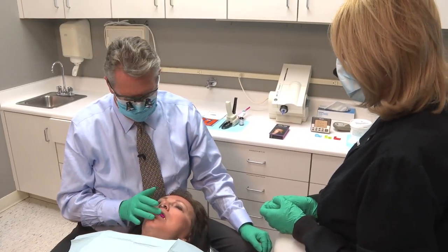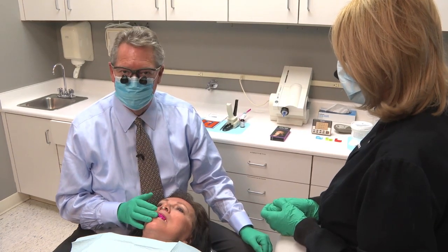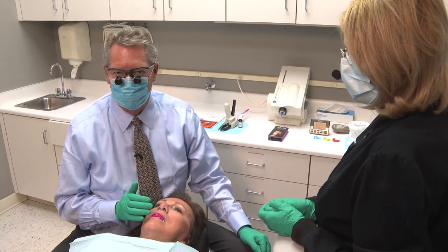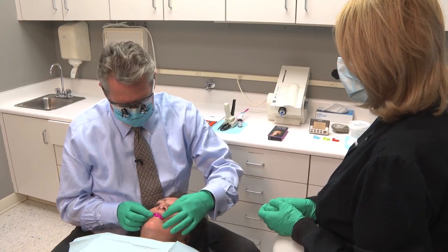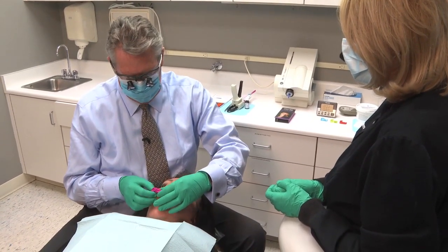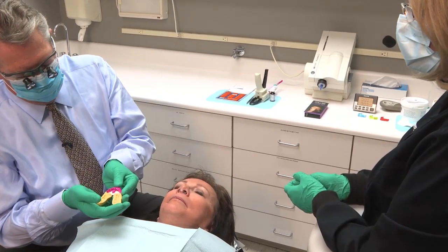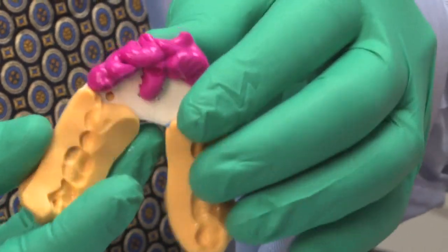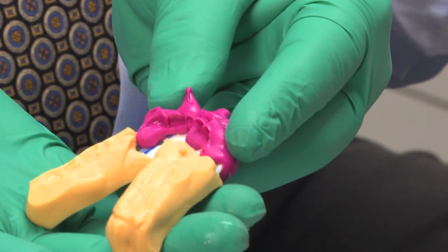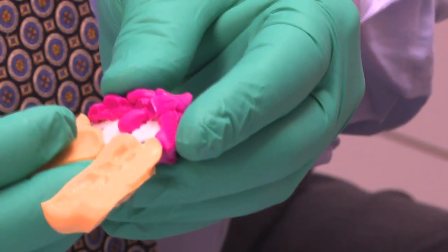So we've verified that our Futar D is completely set. And once again, the reason we do this is so we have an anterior stop to ensure a proper mounting of your models in the laboratory. Go ahead and open, Kim. Great. And we'll simply remove it. And we can now see that we have anterior indentations so that we have that anterior stop to properly mount the models in the laboratory.